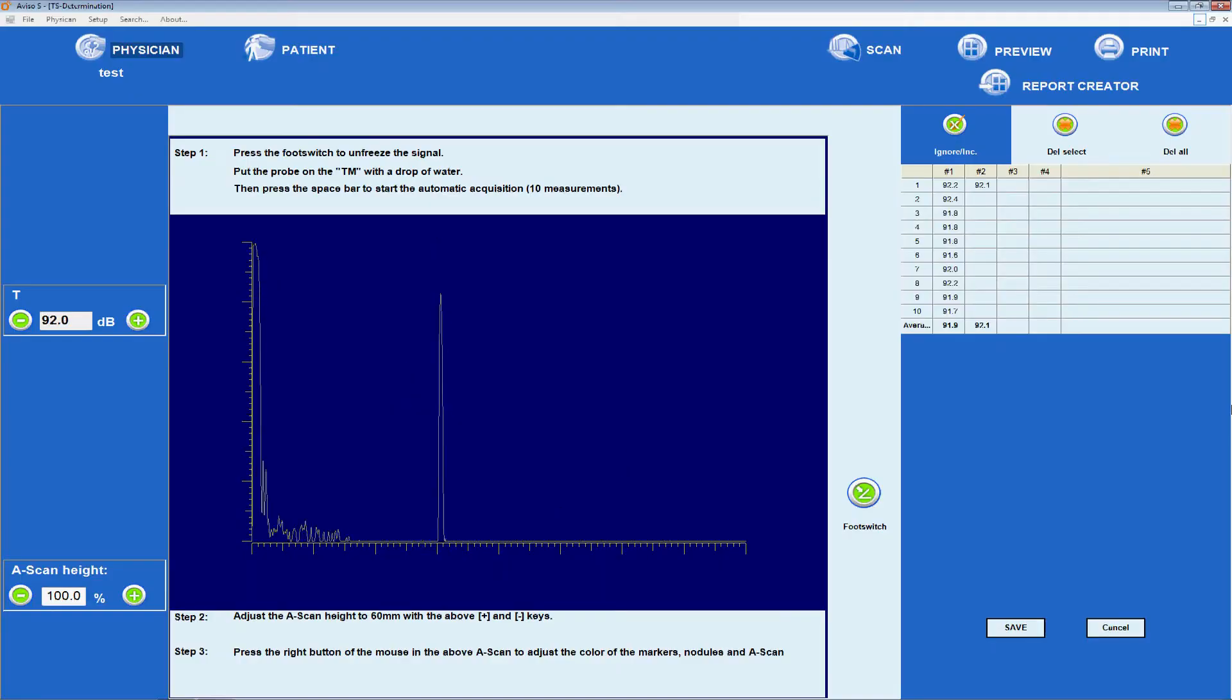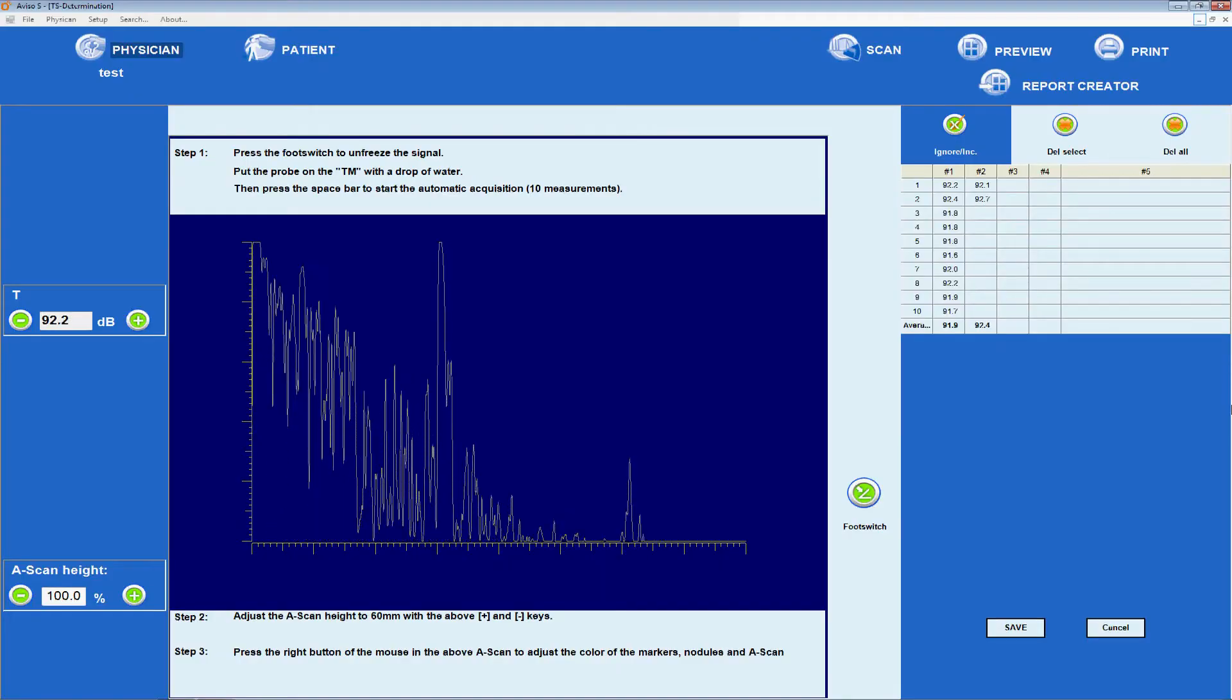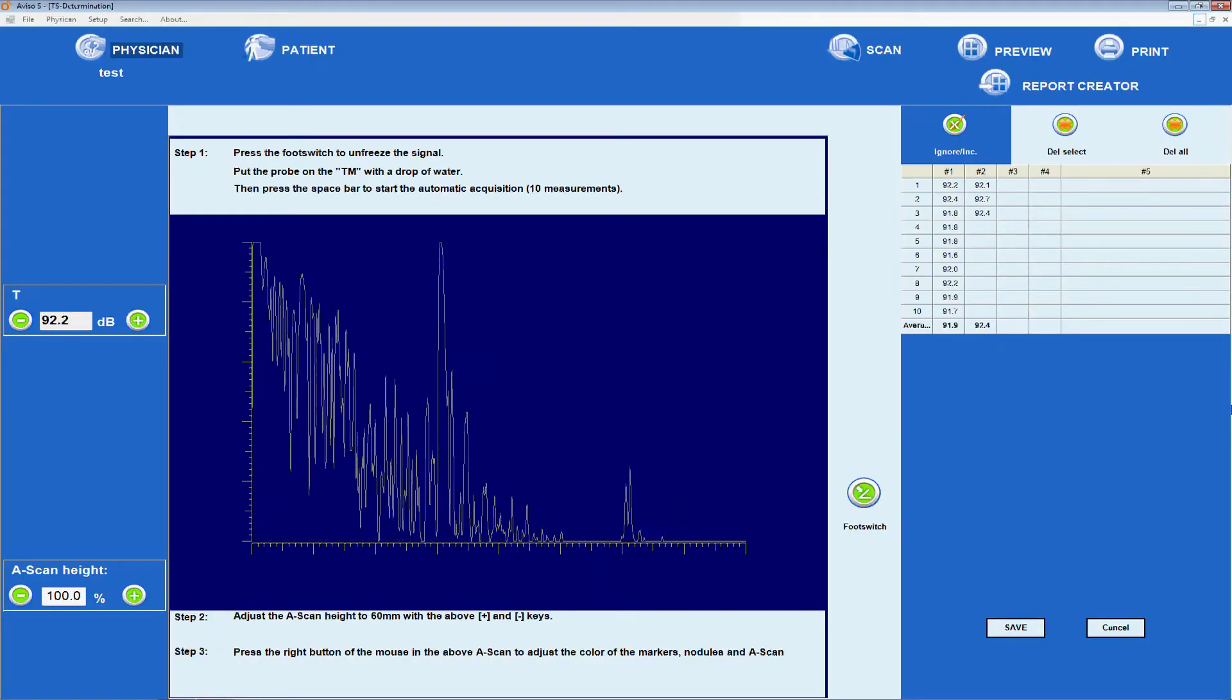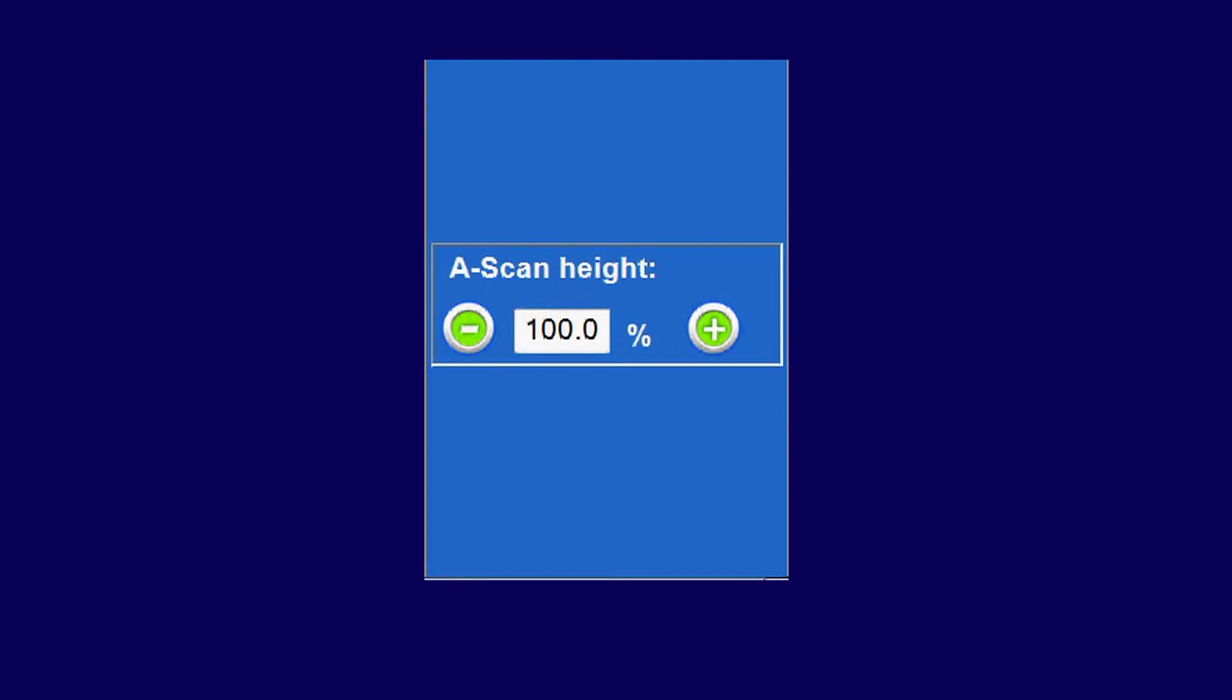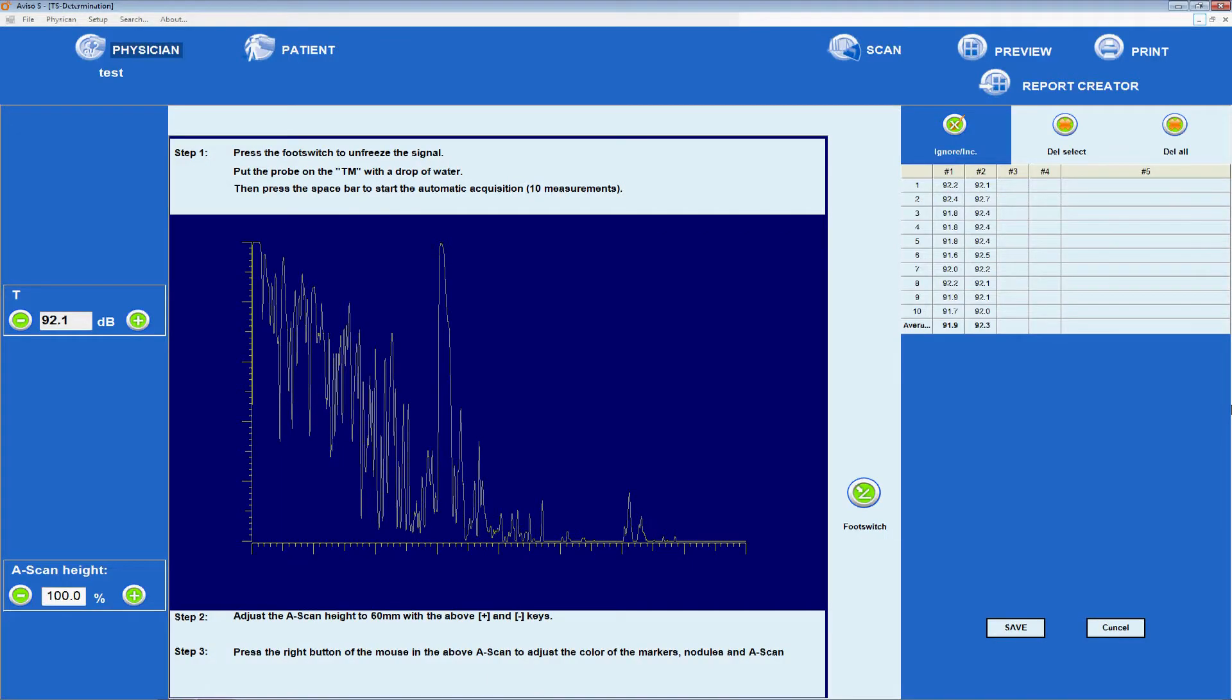In automatic mode, the average is displayed at the bottom of the result table. The A-scan height can be adjusted using the plus and minus icons around the relevant field. The procedure can be repeated five times.